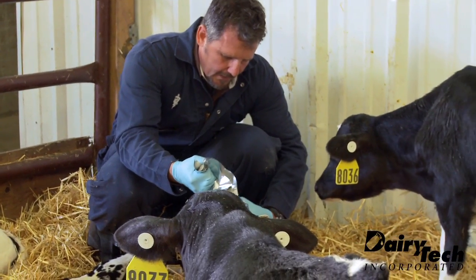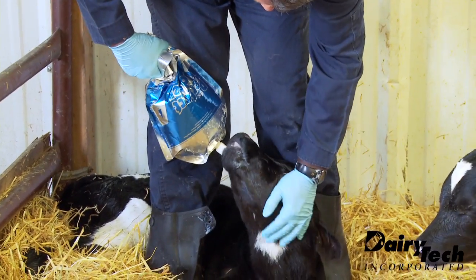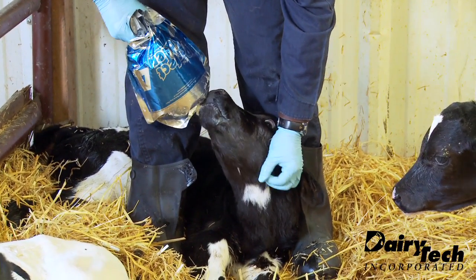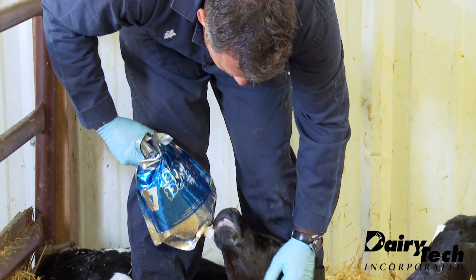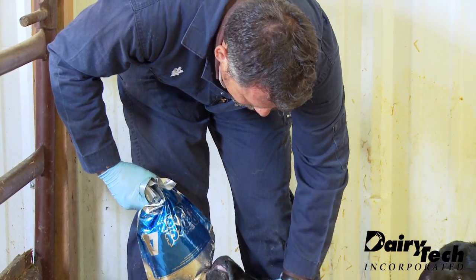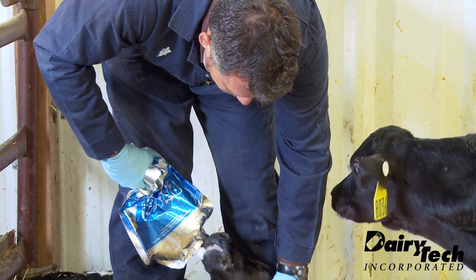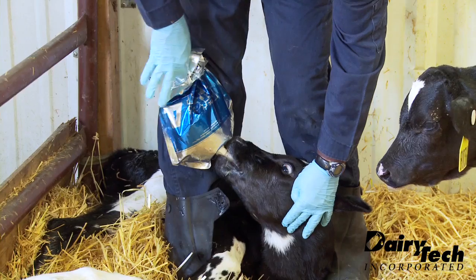If we need to, the calf can be fed laying down. It's good that they just keep swallowing and chewing. Just try to keep the calf up sternal.